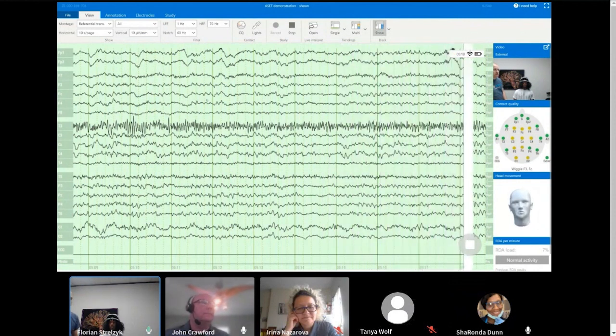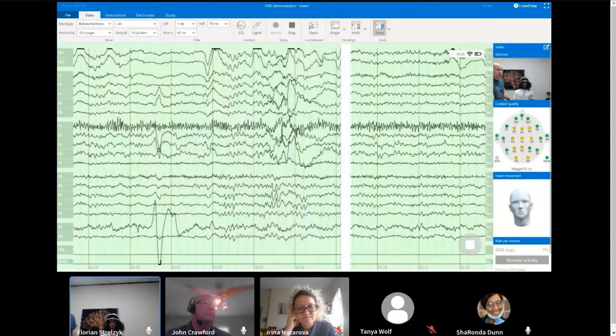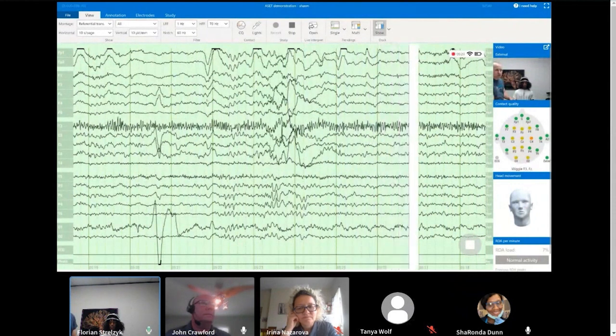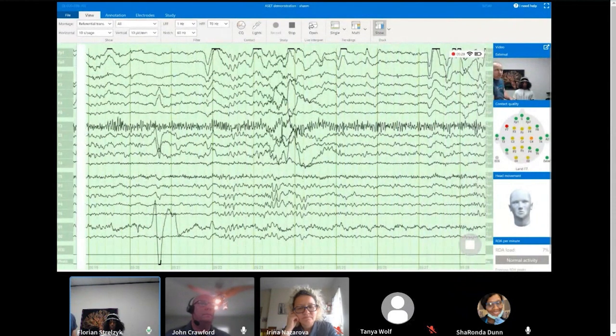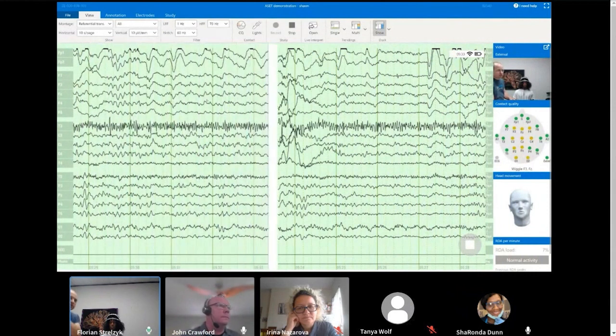So now I have a choice. So we're about at the 5-minute mark. I can fiddle on with the electrodes longer and make them all go green, or I can wait for the electrodes to settle longer on their own. And here it's a little bit a question of what your goals are.